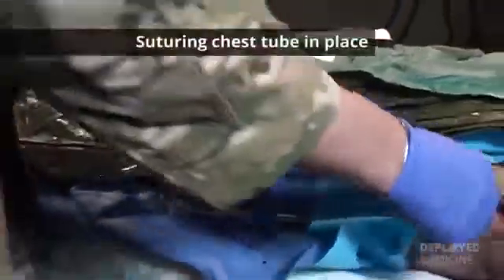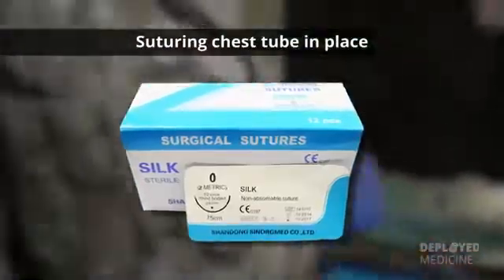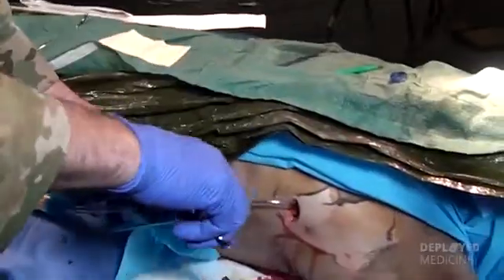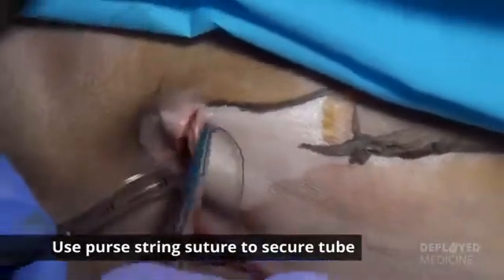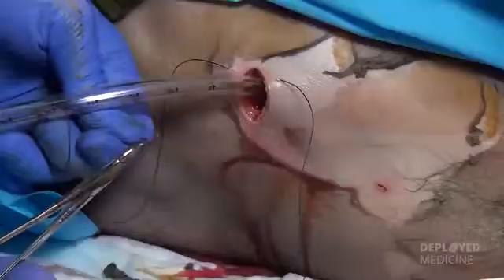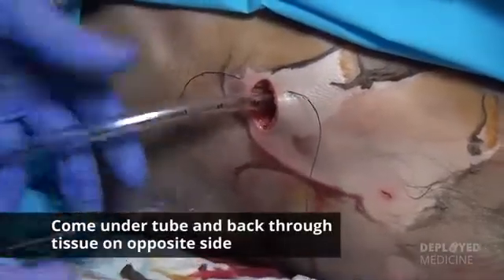All right, let's suture this thing in place. You should have silk sutures or a similar type of suture, O-silk or something like that. When securing your chest tube in place, you're just going to simply do a simple purse string suture. It comes underneath the chest tube like this.